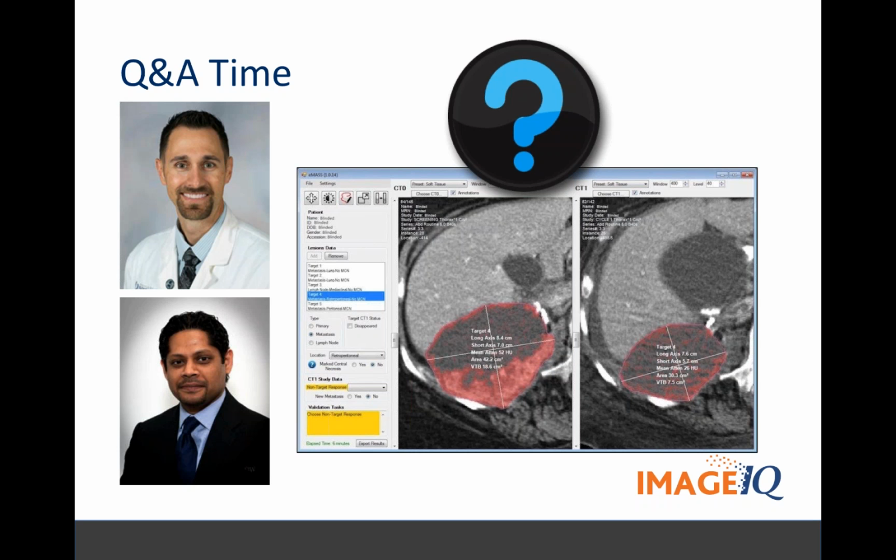And it has all the integrated training that you need. You've got recorded web training, we can do live training. There's all sorts of training that can go around it for compliance and that kind of stuff. So you've got a number of different ways. The other way you could do it, very honestly, is to not deploy it to your sites at all, but have the trial run through something like ImageIQ, and then Andrew's team uses their eMass software for the reading. Then you never touch the software, but you have all the benefits of it.